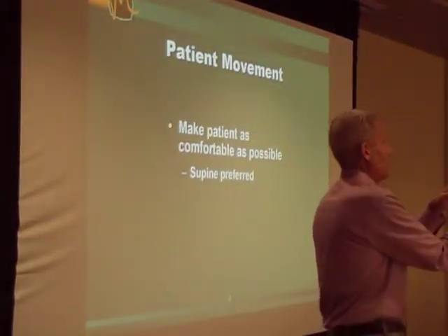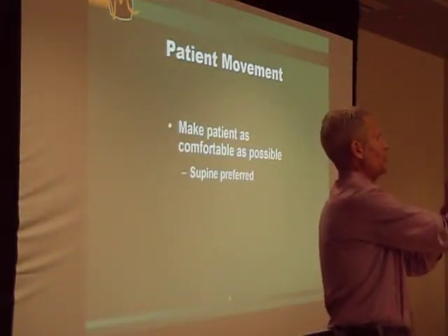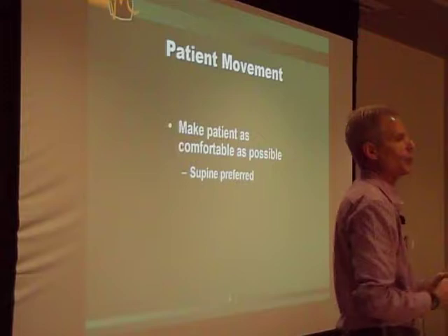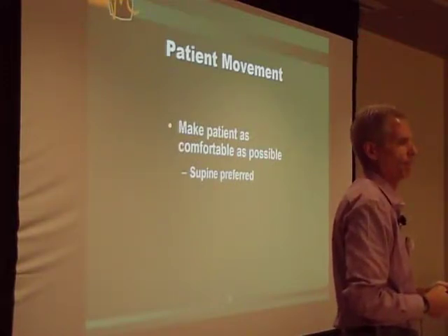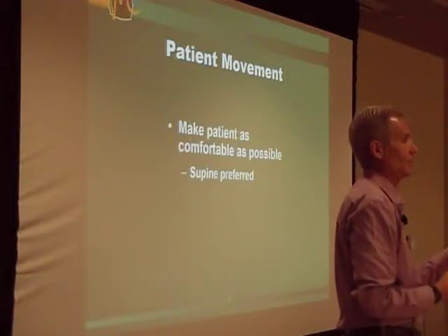So semi-reclined is fine. However, when you get your patient in a bolt upright position trying to acquire a 12-lead, what's the issue with that? It's the wires.